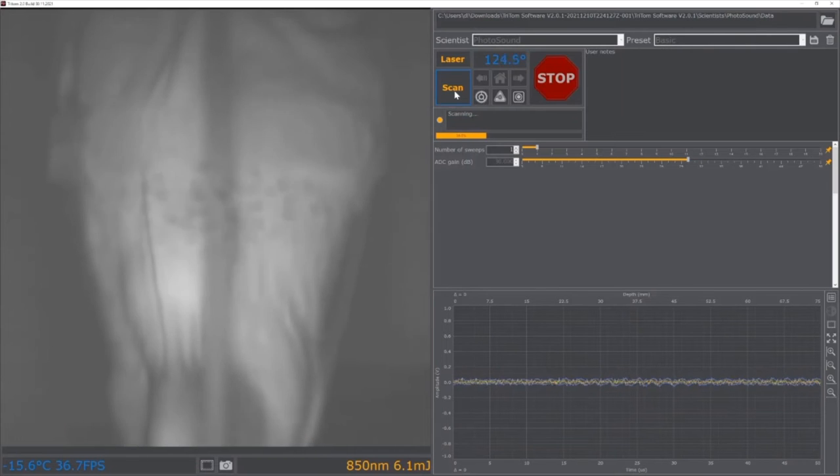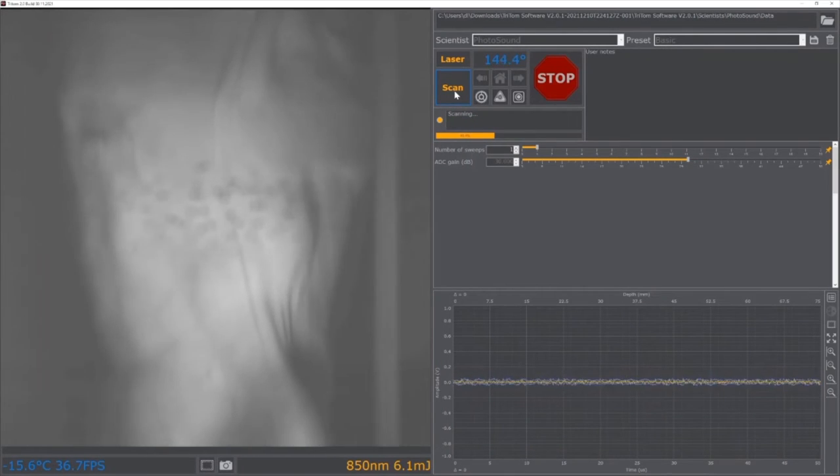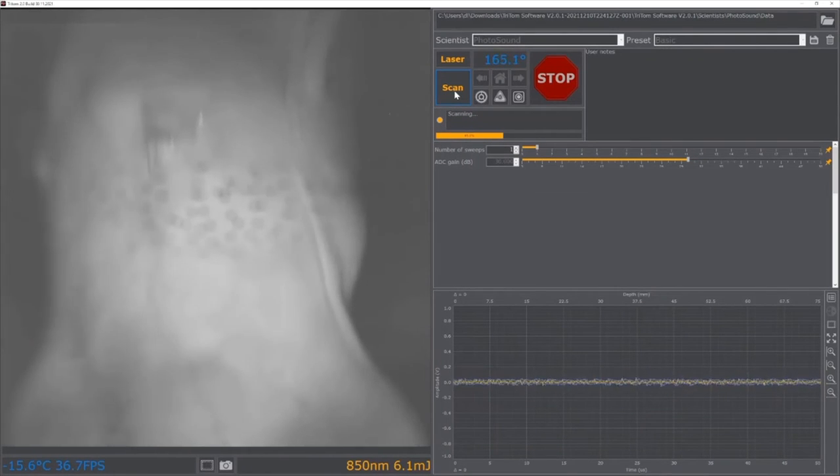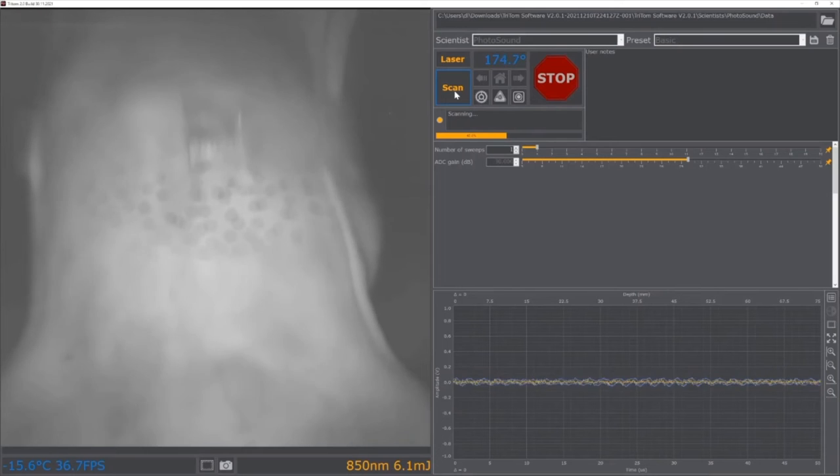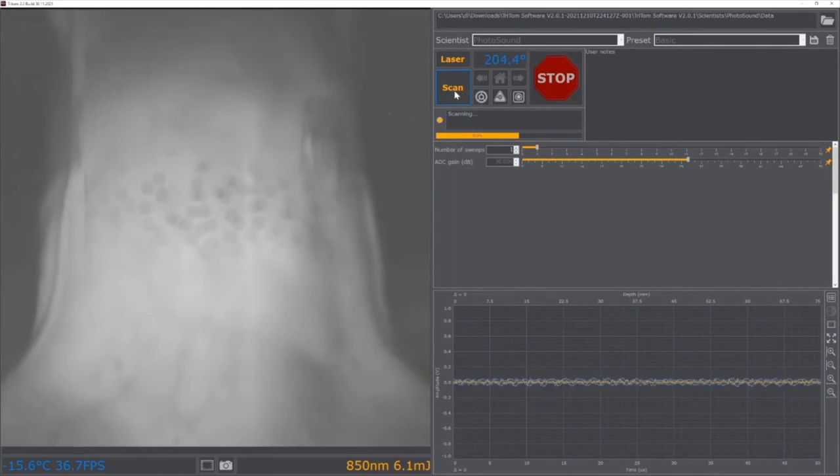Once the scan is complete, the laser will stop firing and the scan data will be saved into the user selected location and be ready for processing.